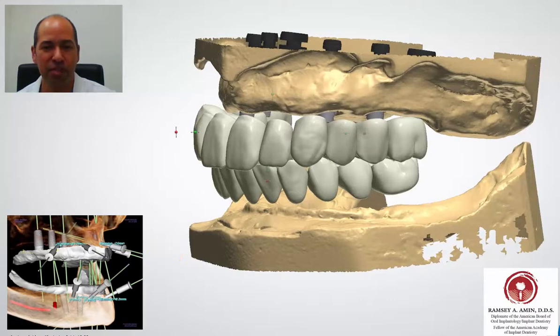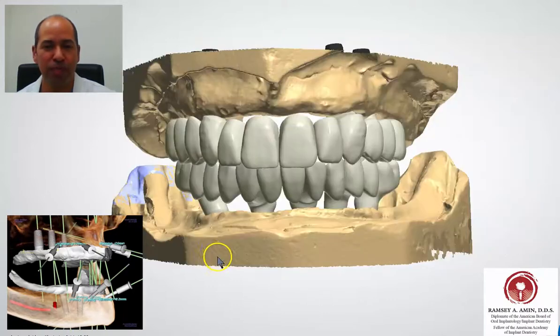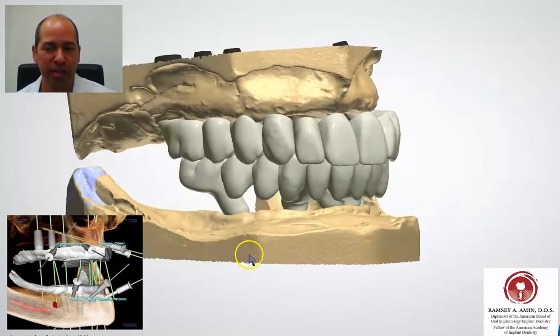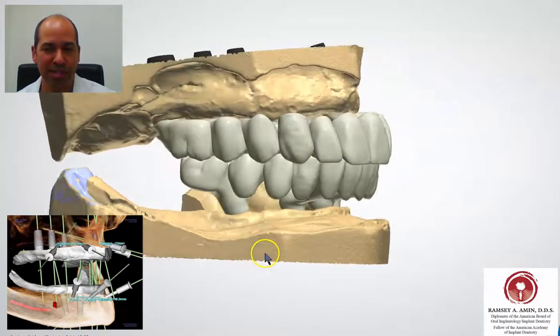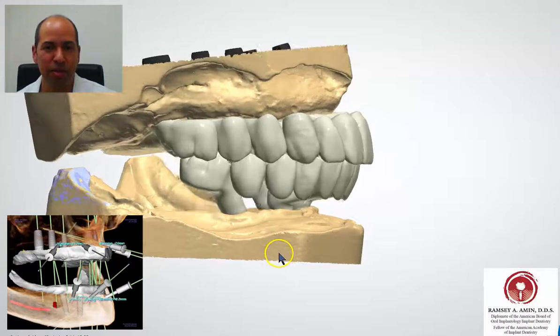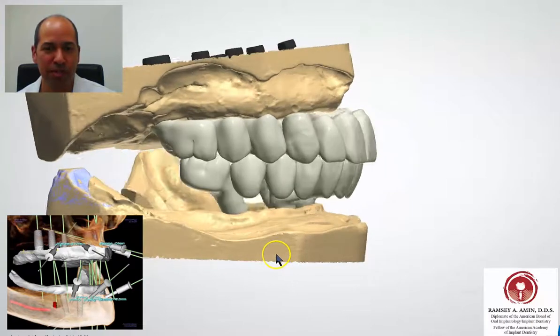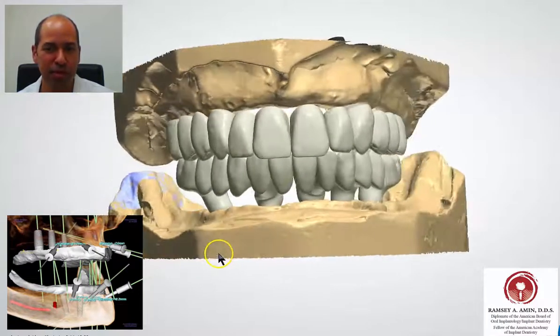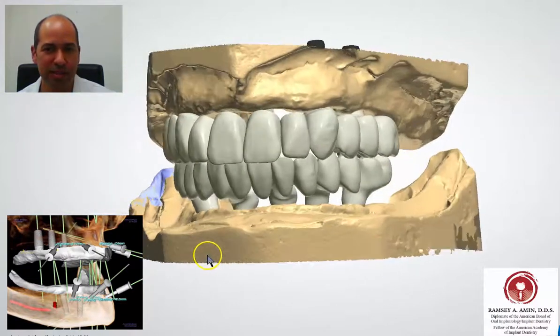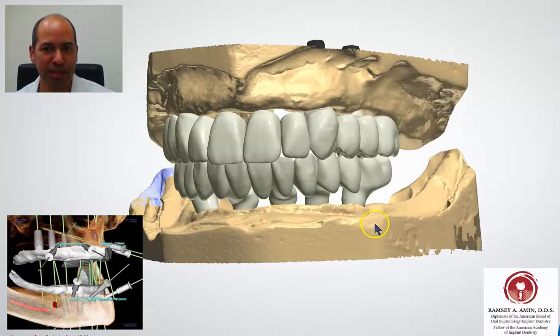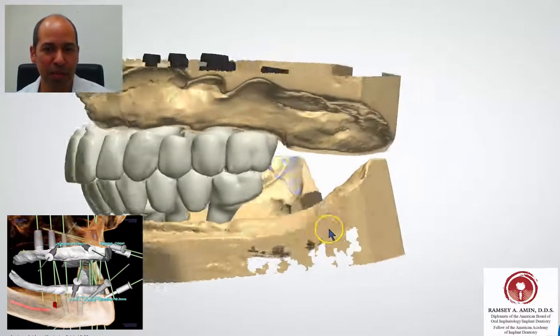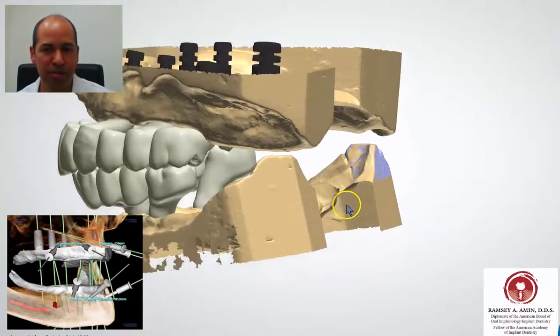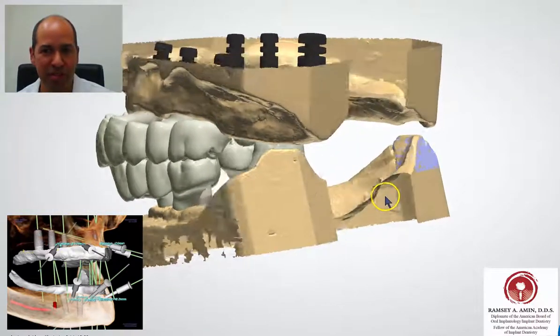The lower left is my virtual x-ray planning on a 3D CBCT, which shows the bone and allows me to make surgical guides to place the implants accurately. This is a double arch case and the final restoration is going to be fixed zirconia.